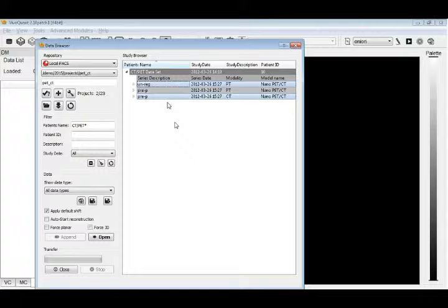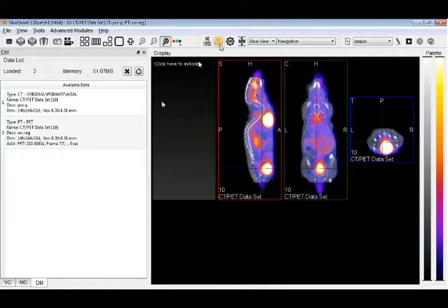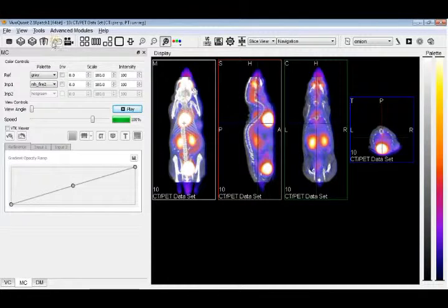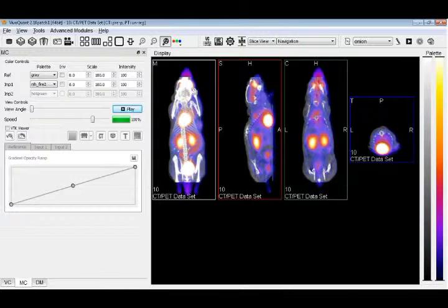So let's say in particular I'm going to grab, here we have two PET data sets, one that was the original, and then we have a preprocessed CT data set and a preprocessed PET data set where the bed has been removed, they've been nicely aligned, but I'm going to start with something closer to the raw data with the unregistered PET data. I'm going to turn on my classic MIP since that one will look nice here. So I have these nice 4 views. I'm going to put this in my paper or my report or something, so I really don't want that crosshair there. So I'm going to turn that off. I'll keep the patient name and the labels and go from there.